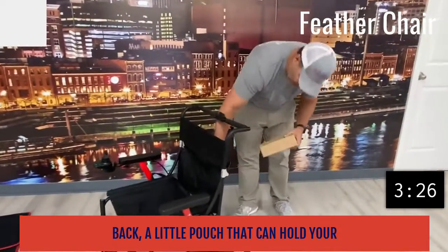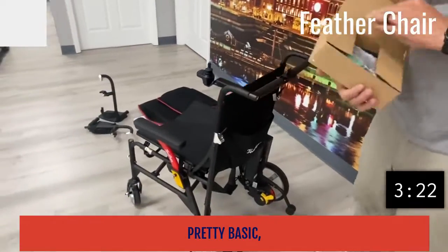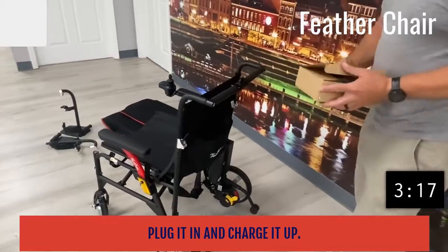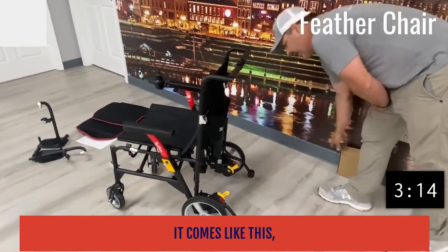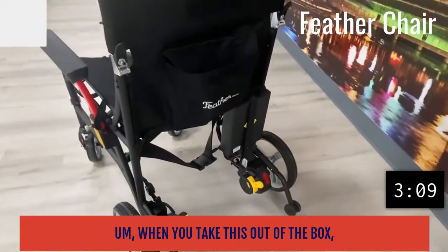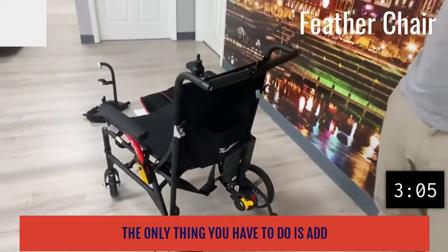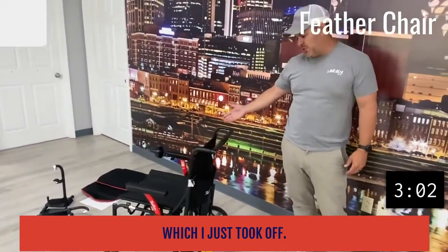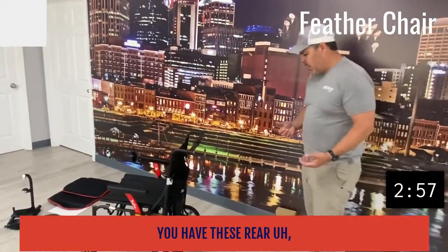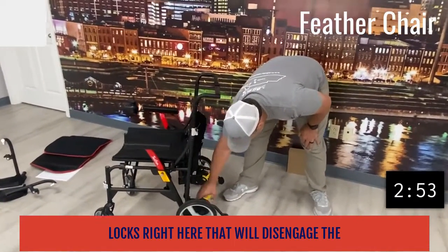You have a little compartment in the back — a small pouch that can hold your battery charger. The battery charger is pretty basic and standard as far as the industry goes; just plug it in and charge it up. Your battery is on the back here; it comes like this and it's two pounds. When you take this out of the box, literally the only thing you have to do is add the leg rests and the padding, so it's super easy to assemble.